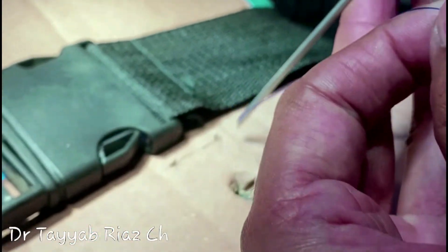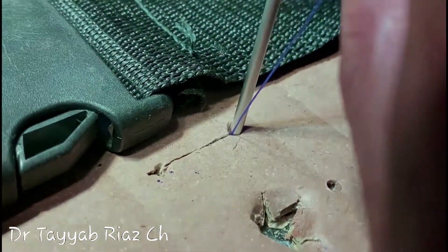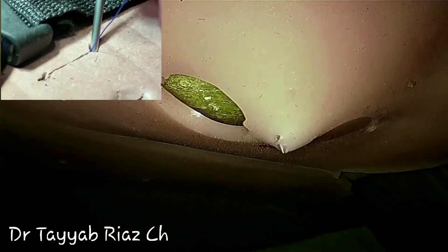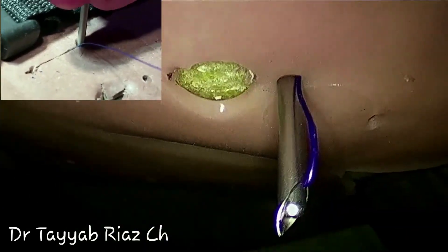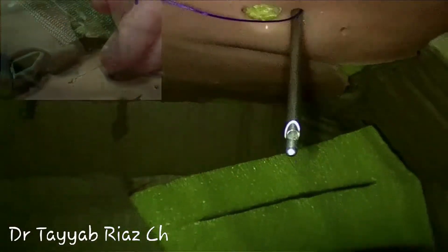After that, you insert the needle through the same 10 millimeter defect and puncture the peritoneum about 1.5 to 2 centimeters from the margin of the defect inside. Then release the stilet and remove the Veress needle.